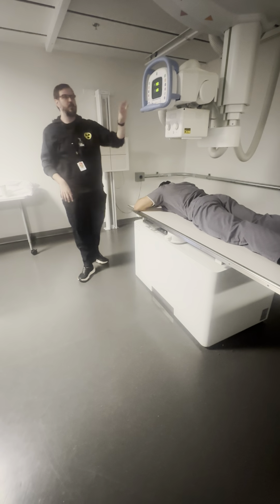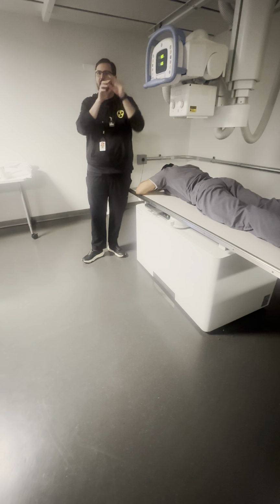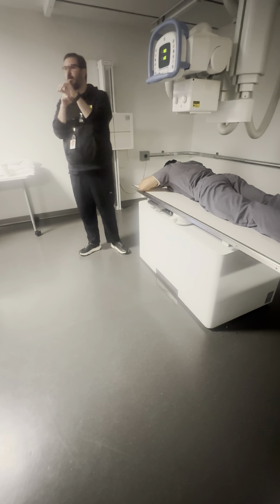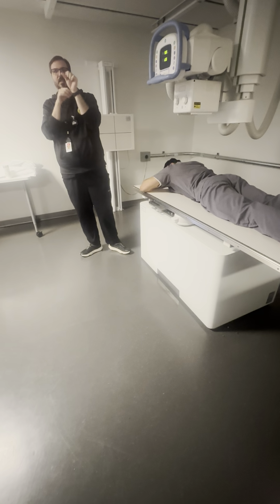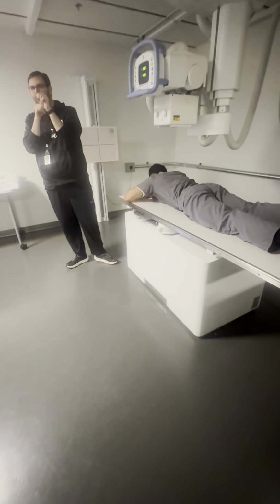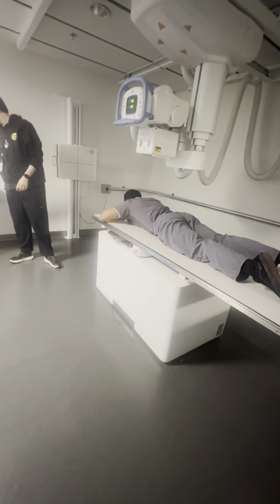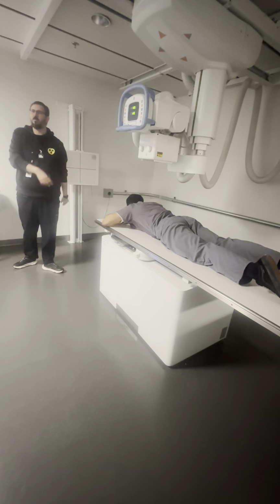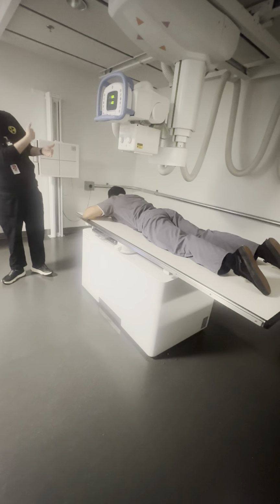The reason that we're going to do the axial is because we need to see up into the fundus and into the cardiac sphincter, especially on patients with GERD or gastroesophageal reflux. You want to see, is the issue the acid in the stomach, or is the sphincter not doing its job properly? So it says on here 35 to 45 degrees. Which direction do you think? Cephalic, because I'm going to look up through there.